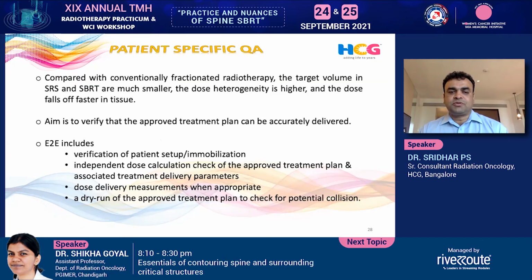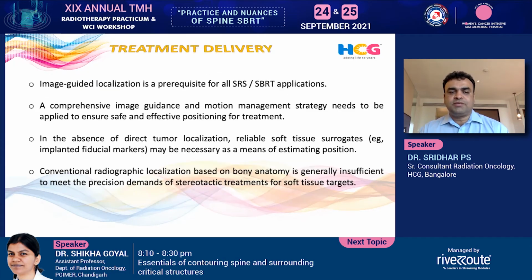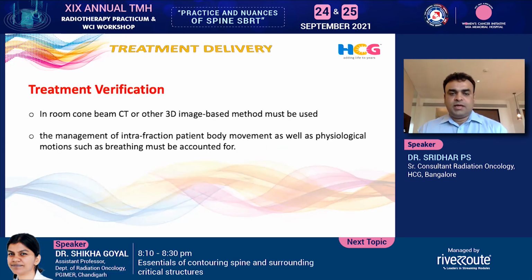The physicist will help you to check, and all the QA they will get done. I don't want to go into detail on that. For treatment verification, it is 3D image based; in the case of CyberKnife, we have a continuous tracking system.